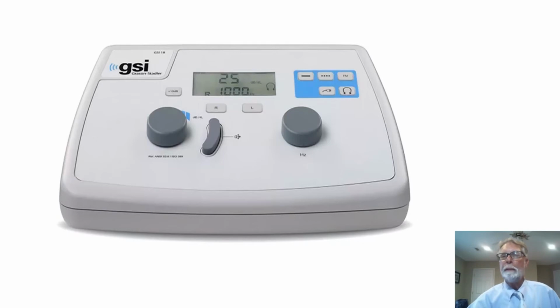The last one, all the way to the right on those 3 buttons in blue, says FM. You probably can't see it. That means frequency modulation. Sometimes it's called a warble tone. That's when you have a pure tone that is modulated. The frequency is modulated just 5%, 5 times a second. So it sounds like a warble tone, wah, wah, wah, wah, like that. It is even easier to pick out from the ambient noise that might be going on because you're not in a perfectly quiet place, and it's a more interesting type of stimulus for children. It's used very often in pediatrics. You can even have a pulsed warble tone.